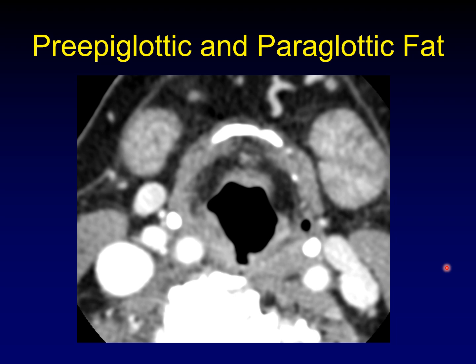Let's focus a little more on the fat planes in the supraglottis. This is the petiole of the epiglottis, and this is the hyoid bone. This U-shaped configuration of fat represents the preepiglottic and the paraglottic fat. The preepiglottic fat is anterior to the petiole of the epiglottis, and the paraglottic fat is laterally on either side. This looks like one continuous plane of fat — there is a fascial plane between these, but it's usually not evident radiologically.